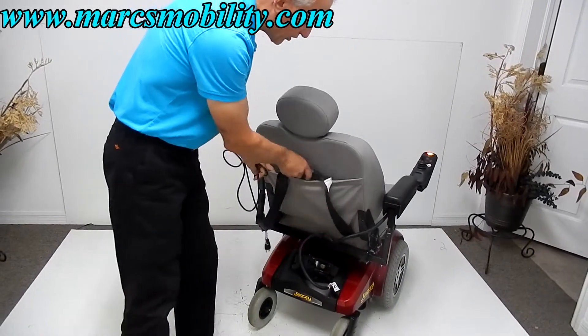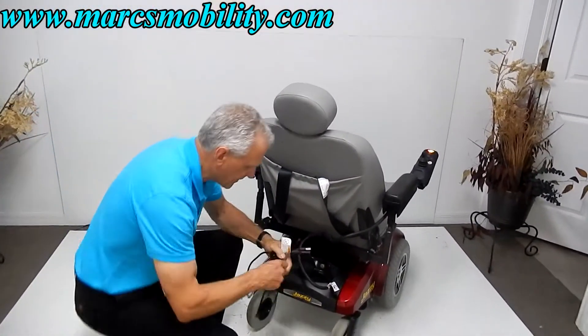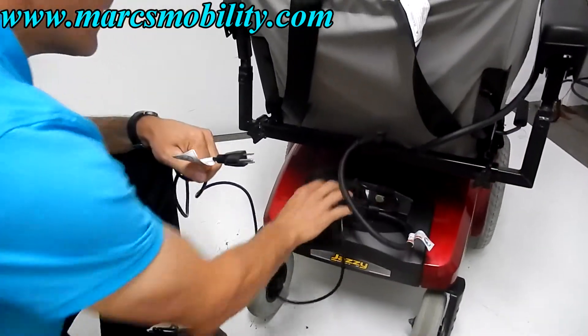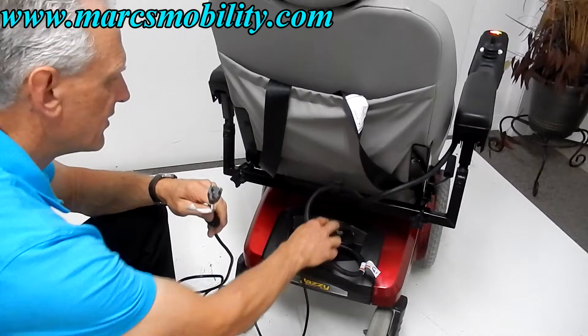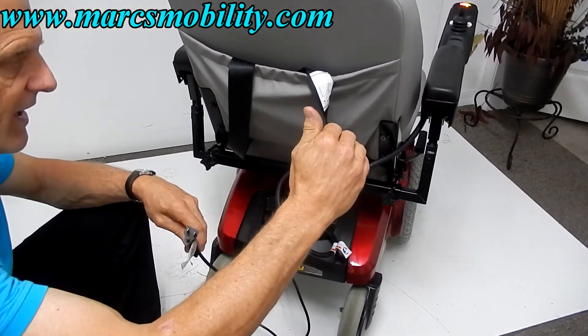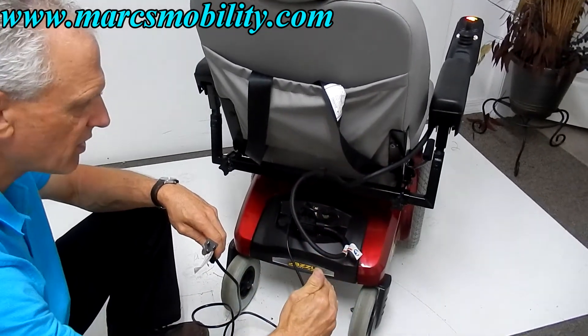This chair has a built-in charger. You take your cord, plug it into the chair right here, and plug it into the wall. There's an amp meter right next to it — the needle will move up to two, four, five, six, then move back to zero when it's fully charged.